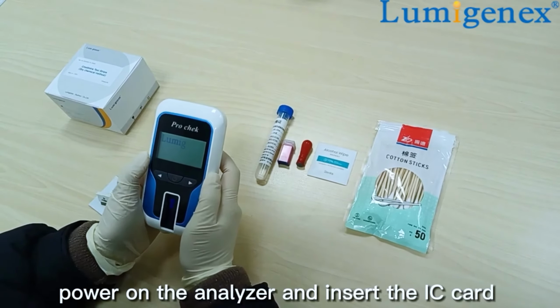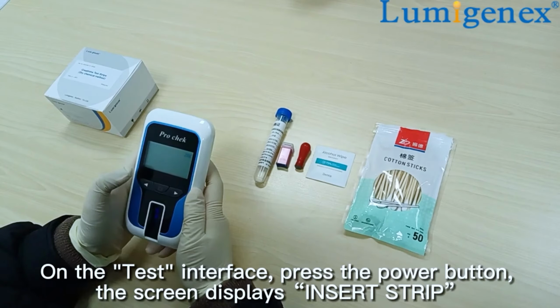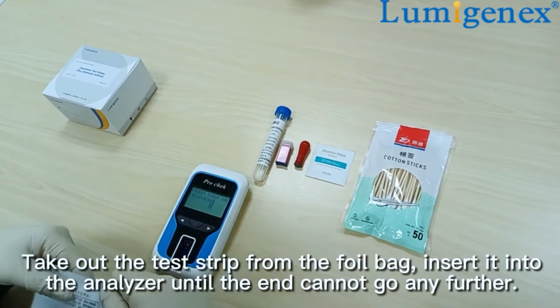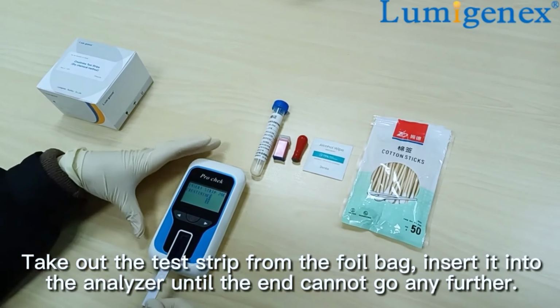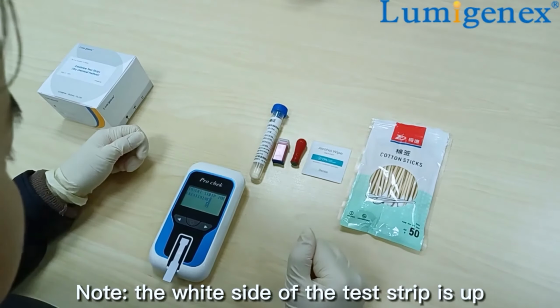Power on the dry chemistry analyzer and insert the IC card. On the test interface, press the power button. The screen displays insert strip. Take out the test strip from the foil bag. Insert it into the analyzer until the end cannot go any further. Note, the white side of the test strip is up.